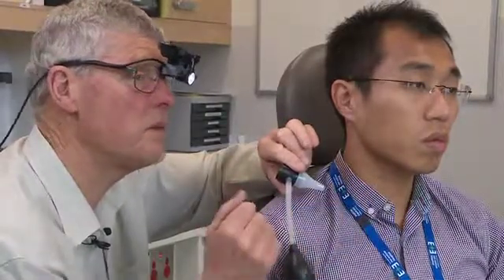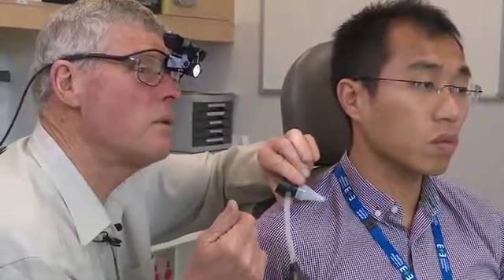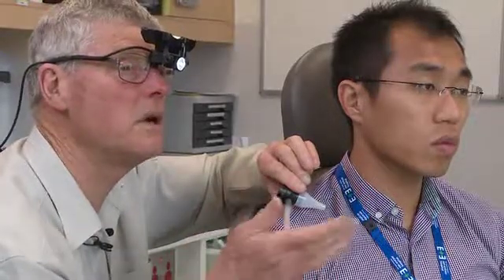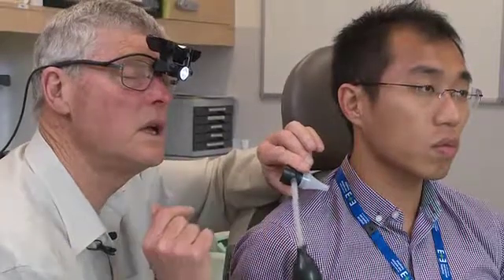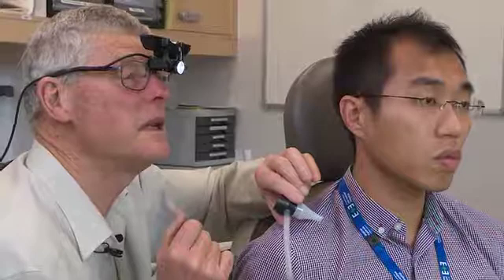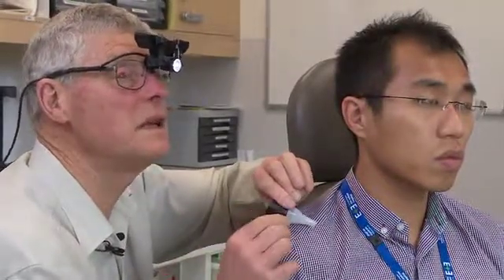And of course if there's a hole, there won't be any movement at all. So instead of — especially with children — about one in every three ears you look at without making the eardrum move, you're really not sure whether it's a healthy middle ear or not. By the time you've got used to using this and a bit practiced, you'll reduce the uncertainty rate down to certainly less than 10%. And then if you get fussy, you'll confirm that by using audiology to tell you whether the hearing's perfect and there's air in the middle ear. But once you've got used to that, you'll get rid of uncertainty in at least 90%.